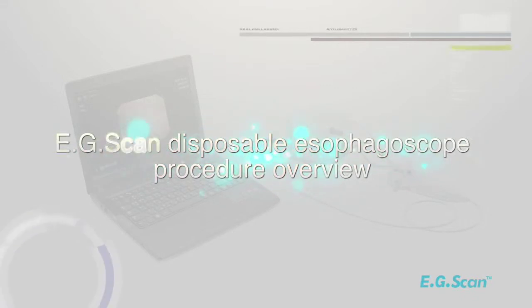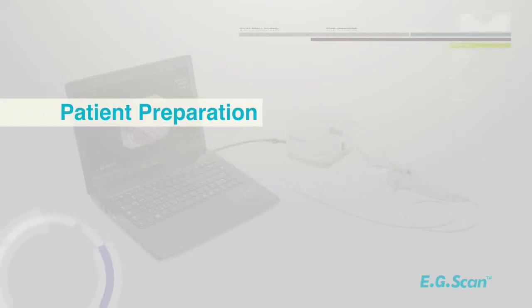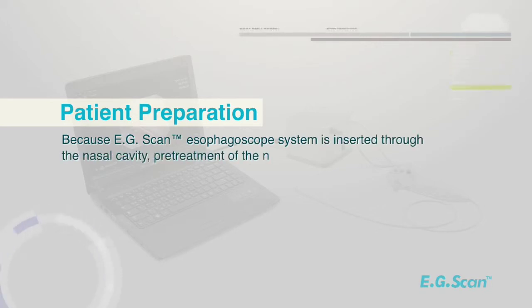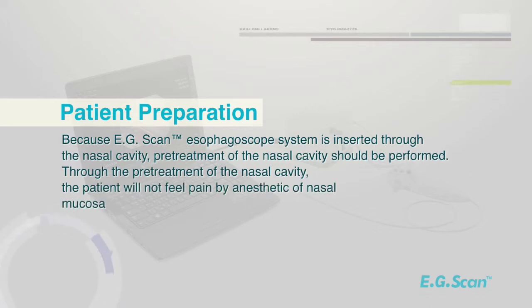EG scan disposable esophagoscope procedure overview. Patient preparation. Because EG scan esophagoscope system is inserted through the nasal cavity, pre-treatment of the nasal cavity should be performed. Through the pre-treatment of the nasal cavity, the patient will not feel pain by anesthetic of nasal mucosa and avoid an epistaxis caused by mild mucosal damage.